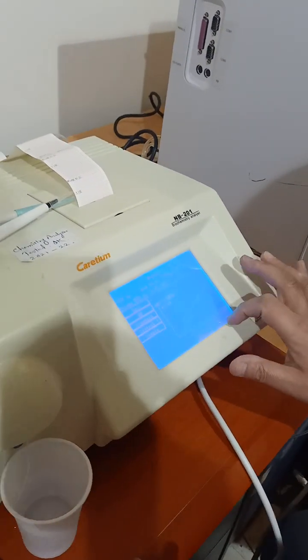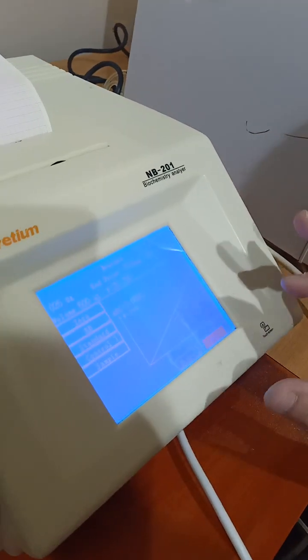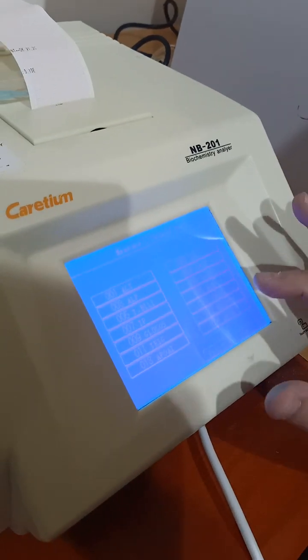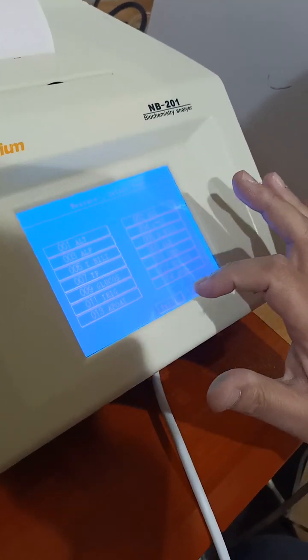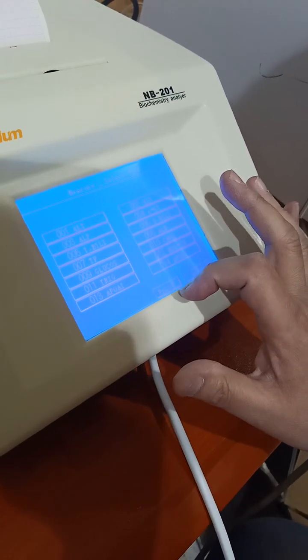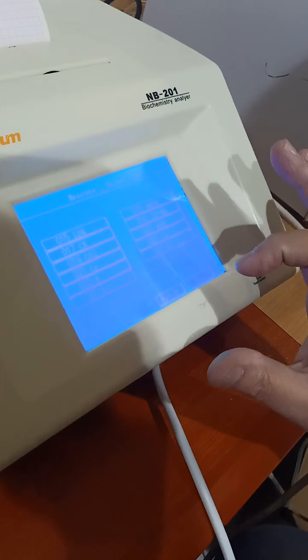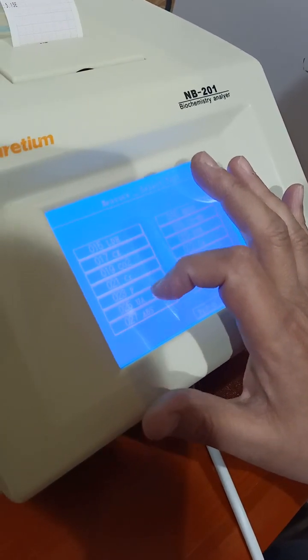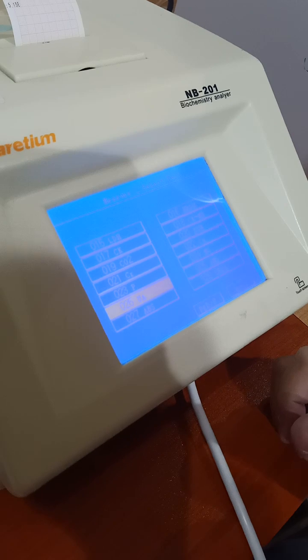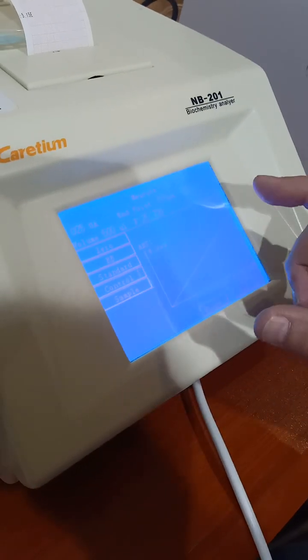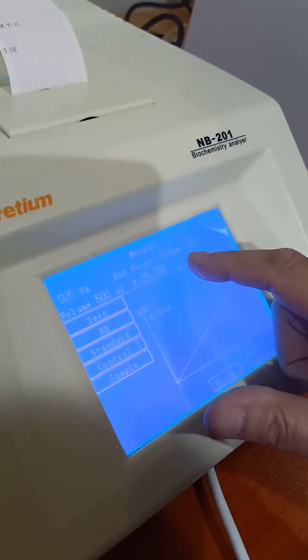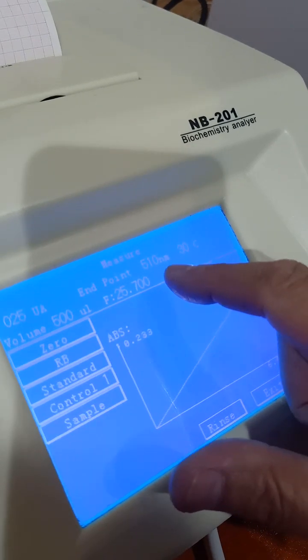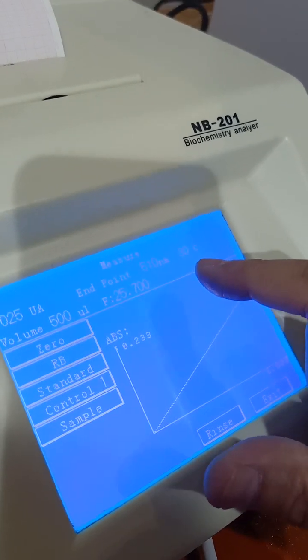We choose from the methods here. For example, if we push here, this is method number 25 is uric acid. So now, the filter will change to the wavelength for uric acid, 510 nanometer.